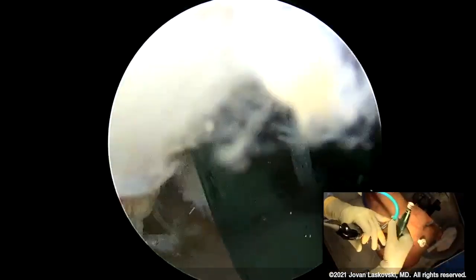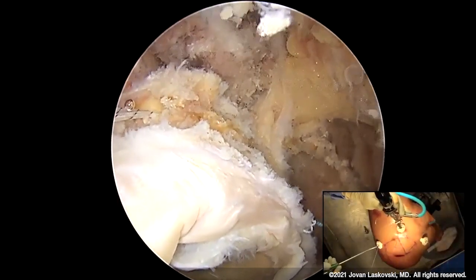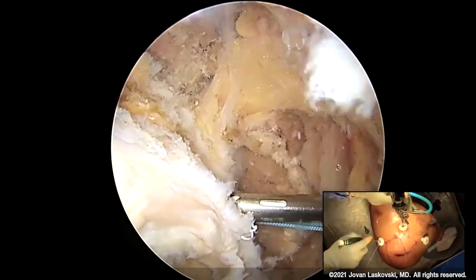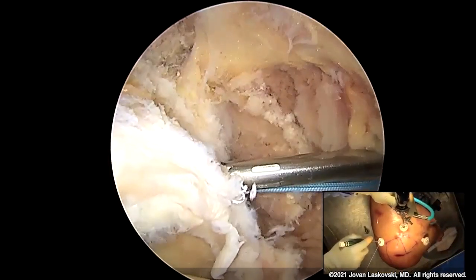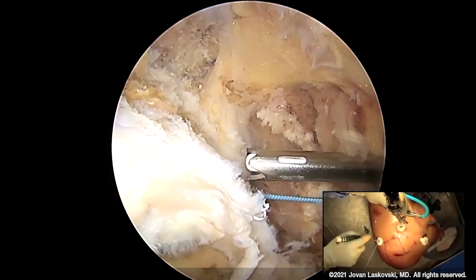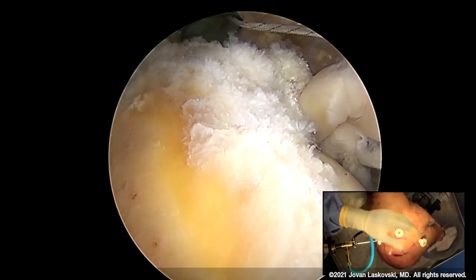We're now viewing through our lateral portal. We can see our glenoid, and through the posterior portal I'm going to come in — you can see this was the angle used to seat our secondary suture anchor. The idea here is to take the complexity out of the system, and what I want to demonstrate is how we build our shuttles.